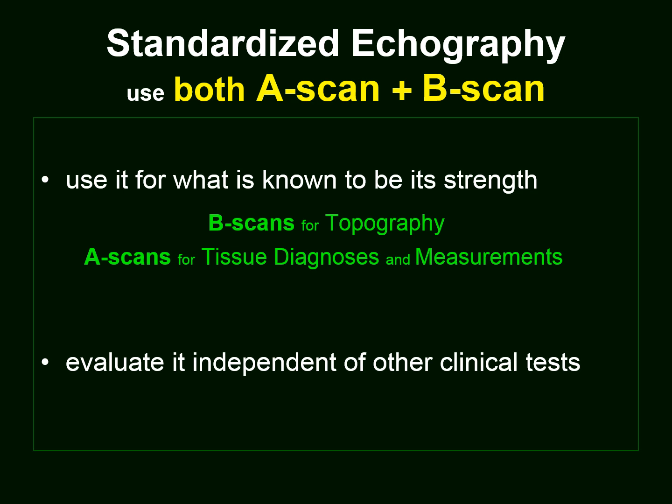Don't be influenced by the ophthalmoscopic findings, by fluorescein angiography in intraocular lesions, or by CT and MRI in the orbit. The diagnosis should be done with standardized echography independently, and then correct results will be obtained.